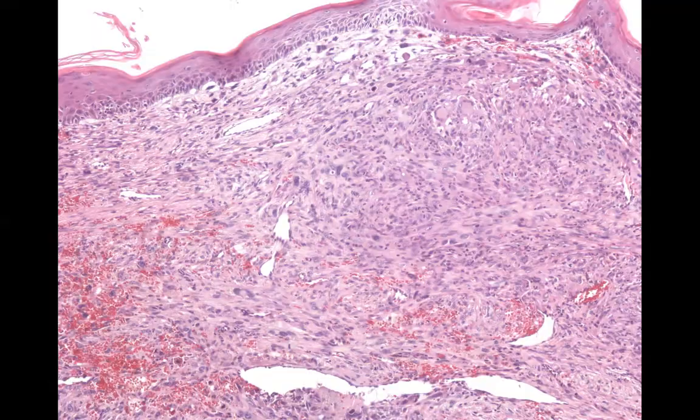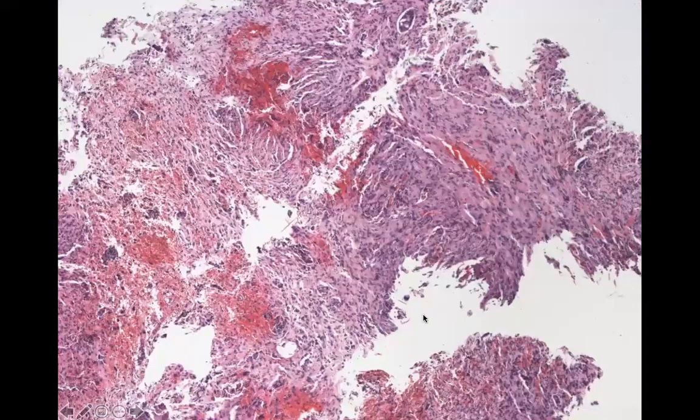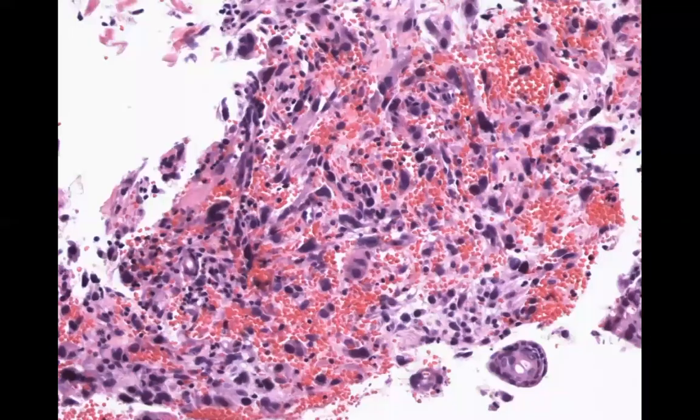If you excise the lesion and see it goes really deep and around nerves and into blood vessels, the diagnosis may change. If it extends into the subcutis or has aggressive features like perineural or lymphovascular invasion, it's called a pleomorphic dermal sarcoma (PDS). Even deeper lesions are called undifferentiated pleomorphic sarcoma — cutaneous UPS is essentially the same as PDS. These are really ugly spindle cell tumors with very pleomorphic cells, some multinucleated giant cells, and truly atypical nuclei.